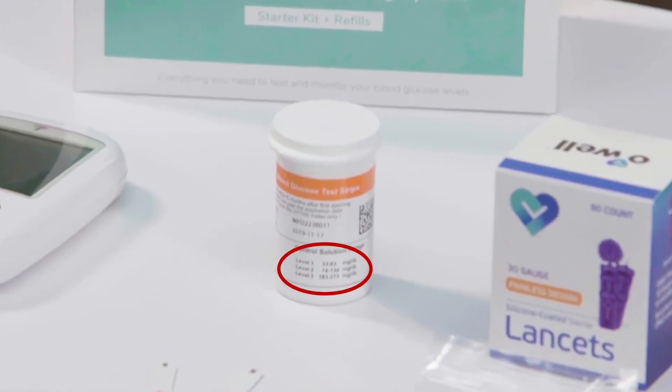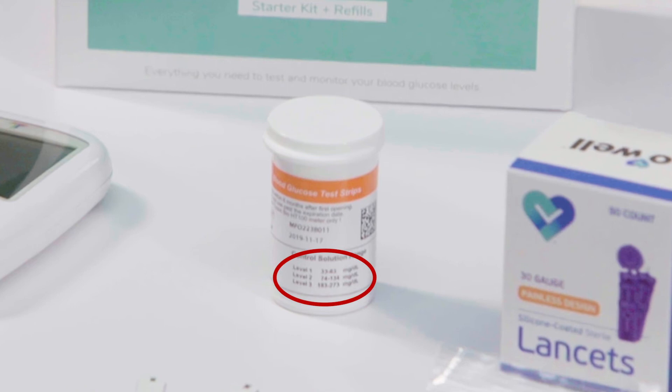If the result on screen is within the specified range printed on the test strip vial, then the glucose monitoring system is working properly.